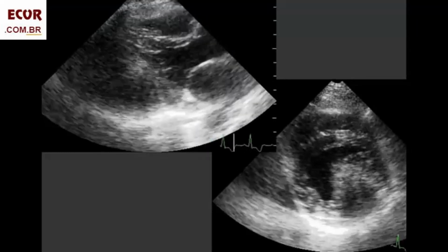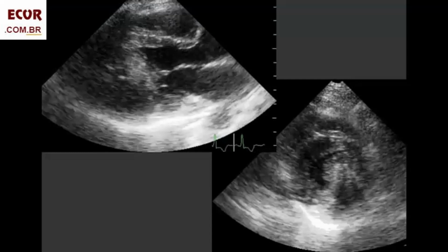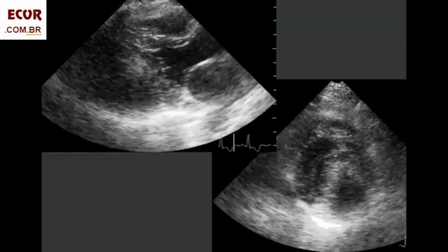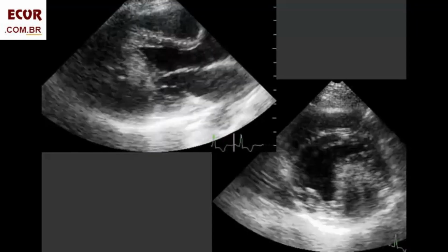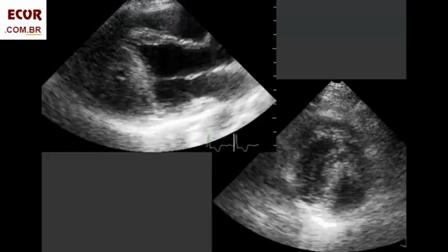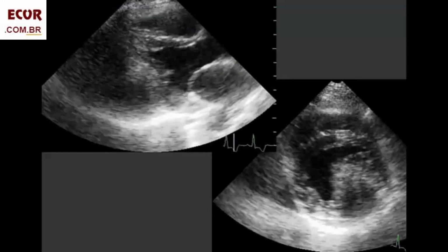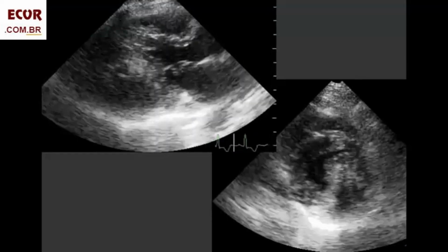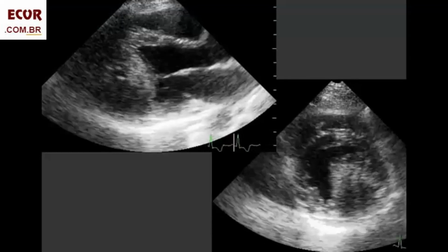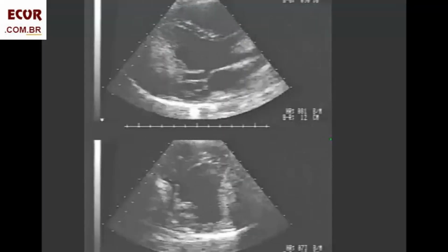This case here has all the main characteristics of a fibroma. It's a single mass, big. It was an accidental finding. The patient had no symptoms, and it's coming from the wall. All this makes you think it's a fibroma, but once again, only surgery and pathology may define the kind of tumor. This is another example.